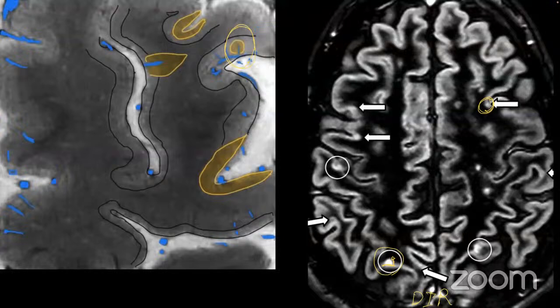As you can see, it's a little bit difficult to pick. It's not the easiest one to pick. Again, this is another intracortical one. These tiny bits, these ones, that one, which looks like a rod within a cortex. So, if you can draw it this way.